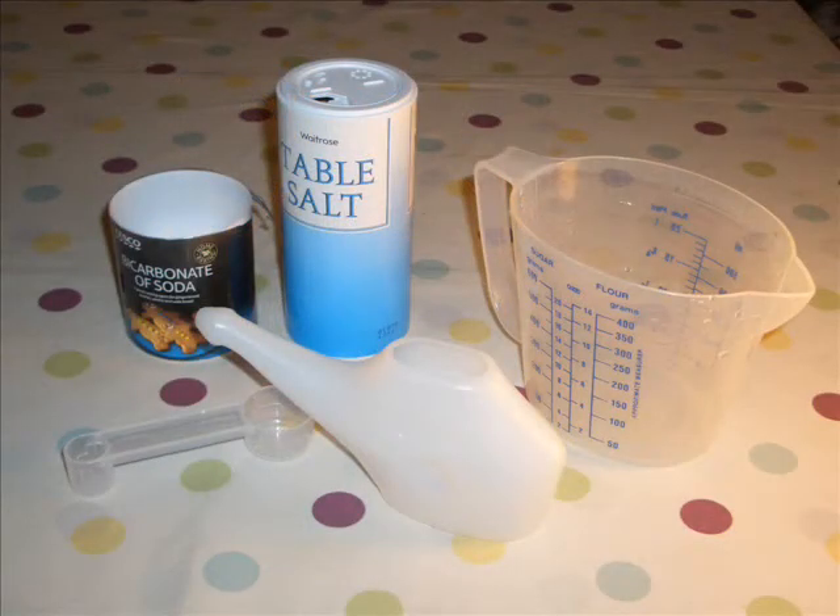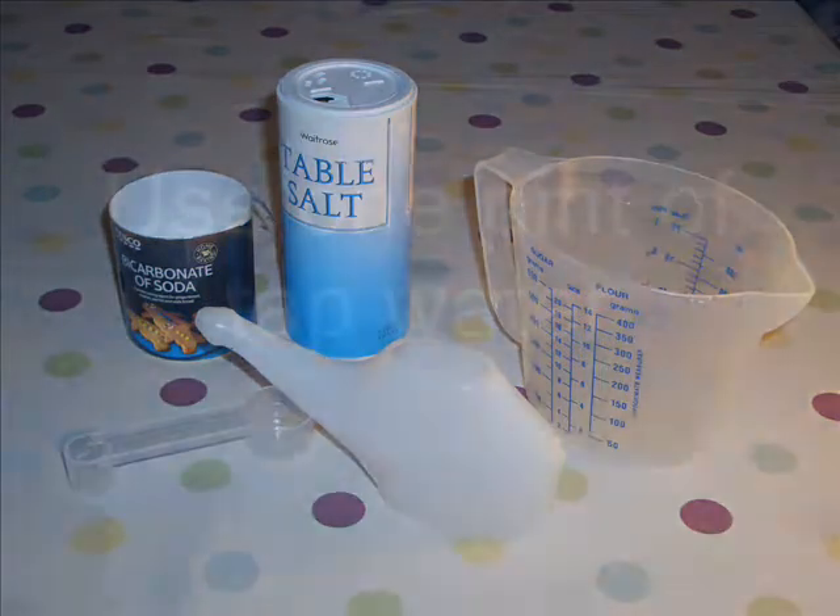To use the neti pot, you will need your neti pot, table salt, bicarbonate of soda, a measuring jug and a teaspoon.